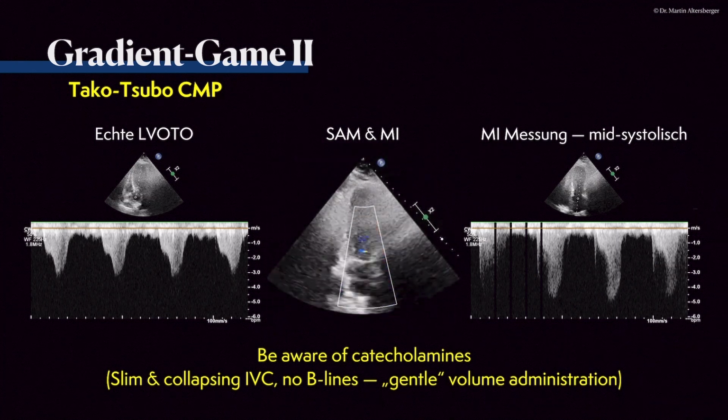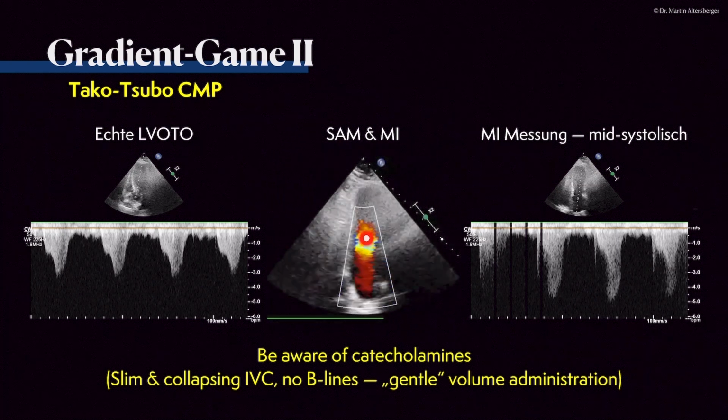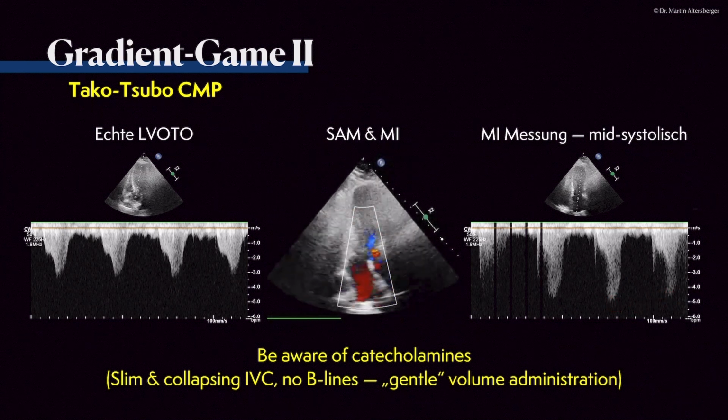Here I have this measurement of another gradient. So this is not an aortic valve or an LVOT gradient. You always have to be careful when you measure here. You see that it is not the aortic valve you primarily measure, but this is the measurement of mitral regurgitation. So always keep in mind where you measure and which gradient fits the actual structures you are measuring and visualizing.